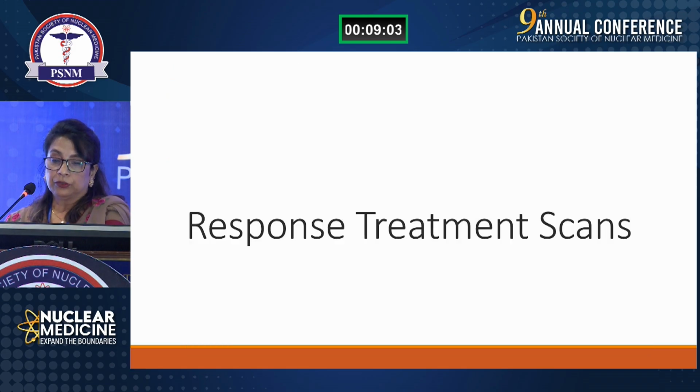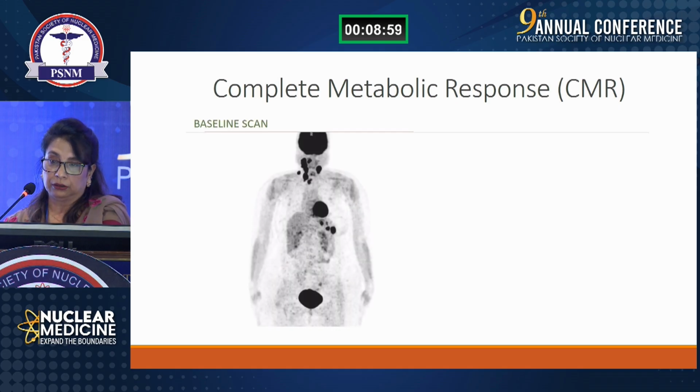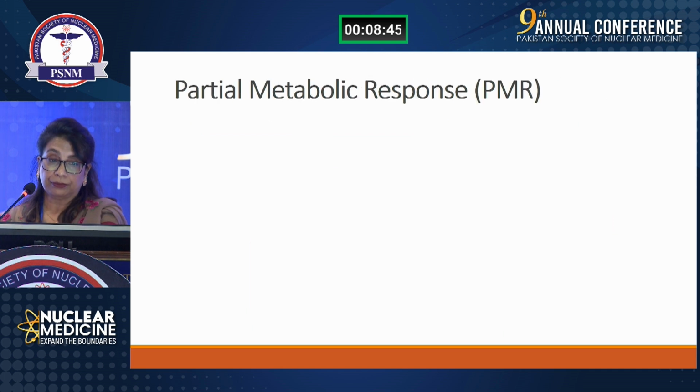So let's look at some of the response treatment scans. Complete metabolic response. So this was a baseline scan and the end of treatment scan where we see a complete resolution of the previously seen tumors with the high uptake of the radiotracer.